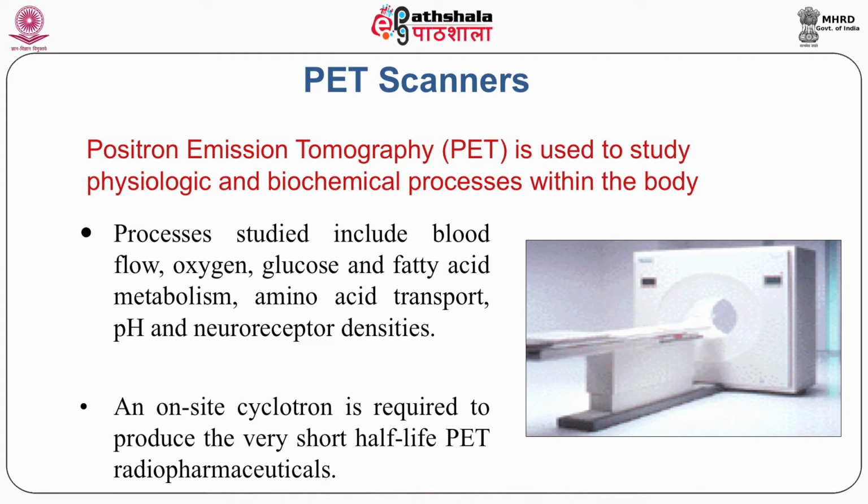An on-site cyclotron is required to produce the very short half-life PET radiopharmaceuticals, because one very important thing is that technetium-99m gives a monoenergetic 140 keV photon, but its half-life is 6 hours. But here the important thing is that the radionuclides used have very short half-lives.